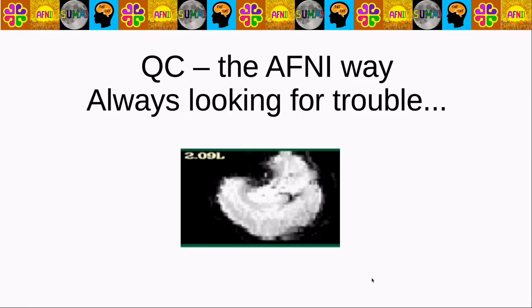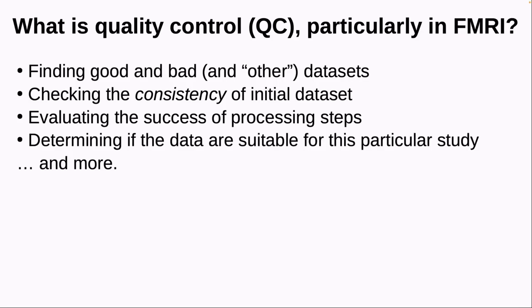We're going to look at quality control done the AFNI way. So let's get started with this. So what do we mean by quality control?